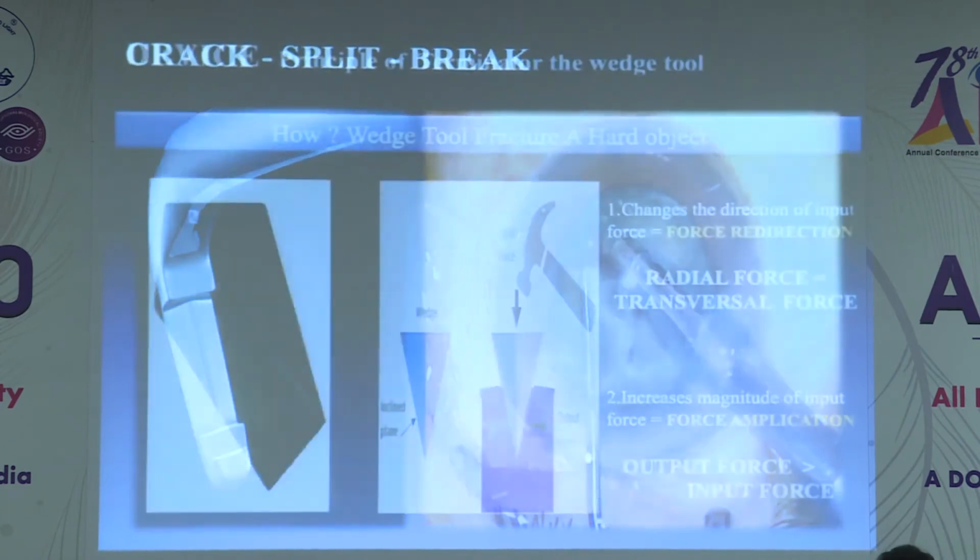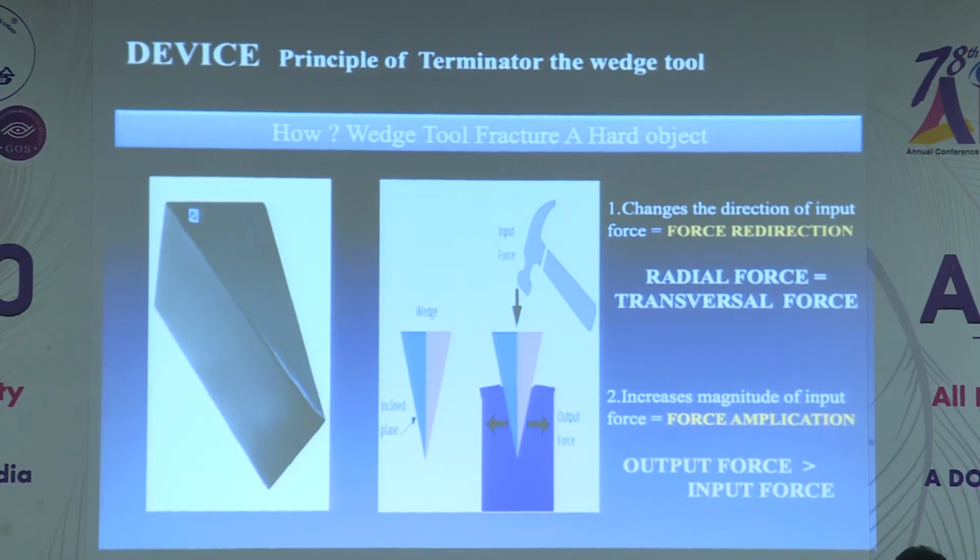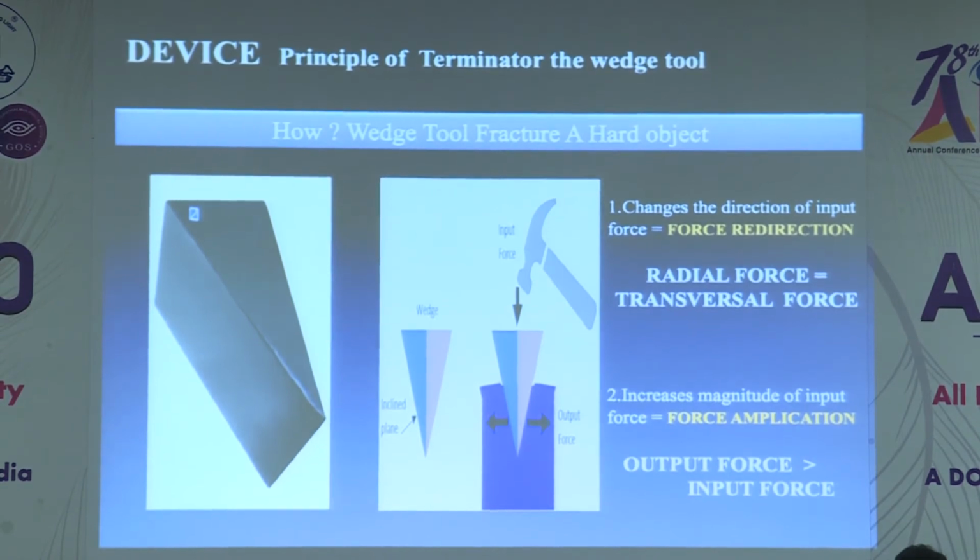So what is the basic phenomenon in the working of this device? See, as I told you, you can see here in this picture, this is the device, this is the wedge inner edge. When the wedge inner edge penetrates into the hard object, what happens? You are putting a force horizontally. This is called force redirection. The force which is put horizontally is transferred transversally. That is called a fracture force. The horizontal force is converted into a transversal force. So that makes the fracture of the nucleus.